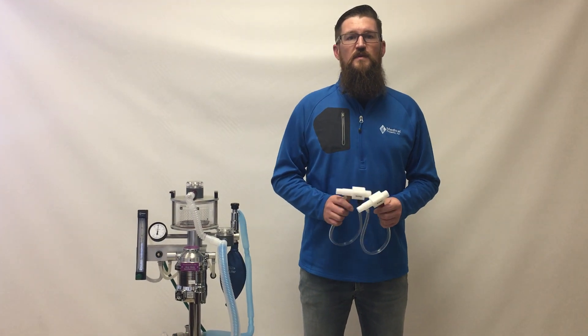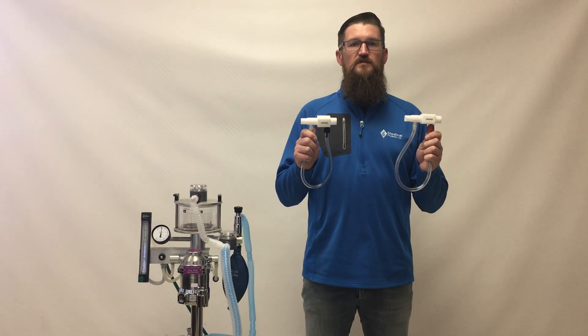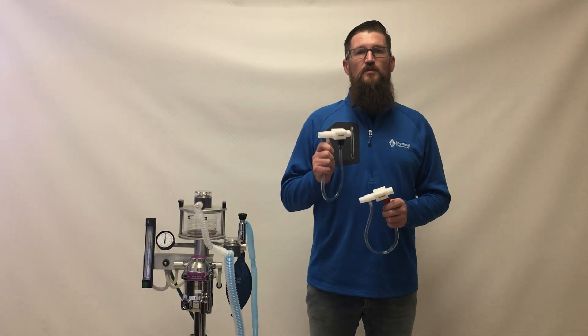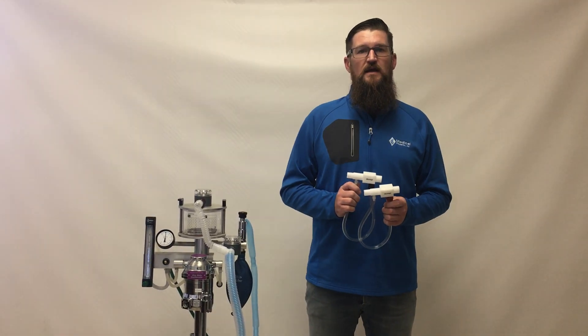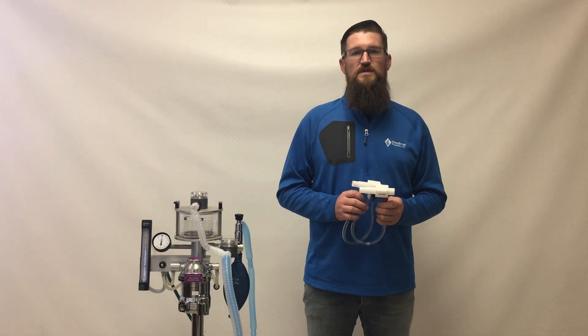Hi, I'm Joe from JD Medical, and I'm here to talk to you about the JDM Safety 20 and JDM Safety 30 safety pressure relief valves. These valves are available for order through Victor Medical at 1-800-888-8908 or by contacting your local Victor Medical representative.